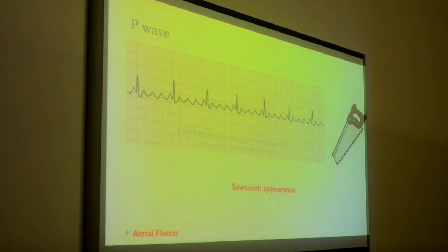I wasn't sure whether I wanted to talk about this or not. But okay, I'll tell you, because you brought it up. Normally, atrial flutter doesn't look like this when the patient first presents. Atrial flutter will usually present with tachycardia. In fact, usually, atrial flutter will come with a heart rate of 150 beats per minute. If you see 150 beats per minute, this is most likely atrial flutter. It can be other things like sinus tachycardia or atrial fibrillation even.